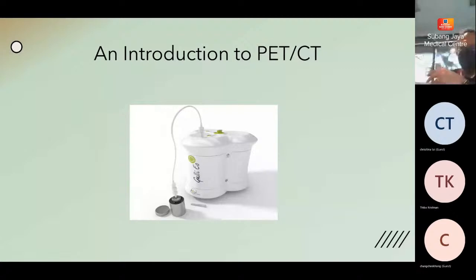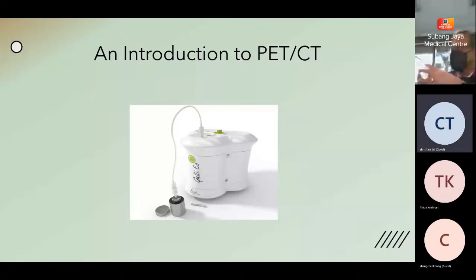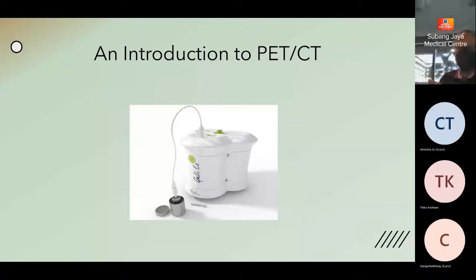Now, with the generator, it is needed. The problem is that a generator can only produce so much of radiopharmaceuticals at a given time. Because of this, the cost of the isotopes is quite high, because these generators are not cheap. Right? And it's only produced by a few countries, and because of that, the price is always on the high side. And we try to reduce the price of our scans, mainly because of this.